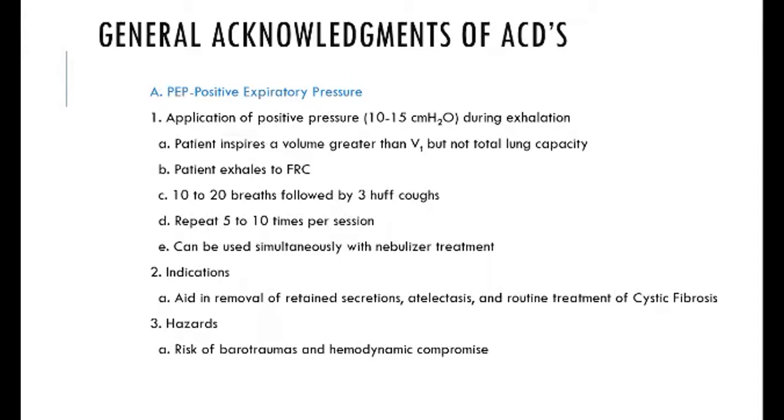It gets the pressure behind the secretions, and then you do a huff cough, like that, right? That will push that stuff up out of the alveoli into the larger airways, and then I can do what? Cough it out, right? So that's important. Technique is very important because they can get all that stuff good and up and then you let them do it wrong and they're not benefiting, right? You're doing therapy for them to benefit, okay? So 10 to 20 breaths through that PEP device followed by three huff coughs.